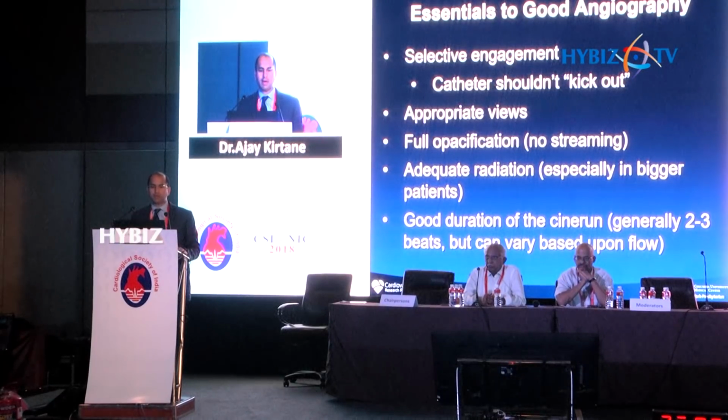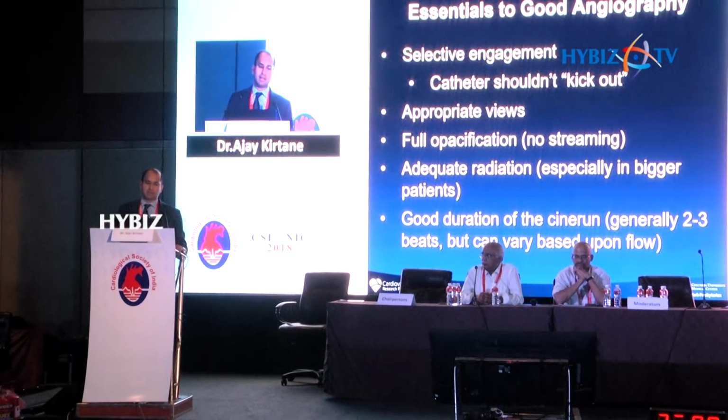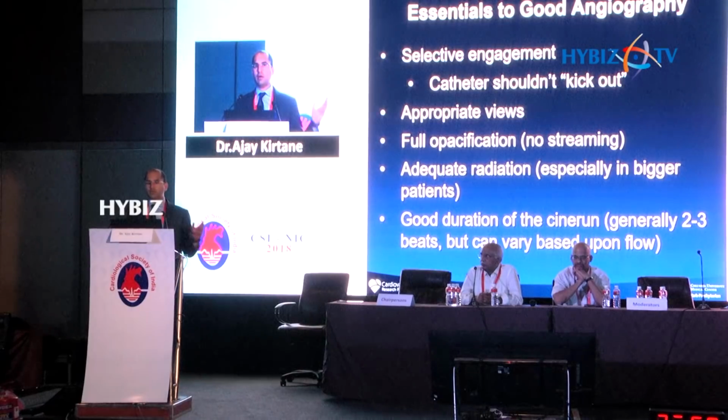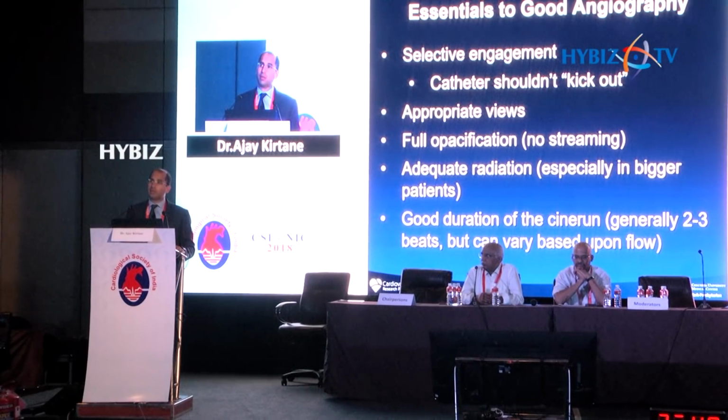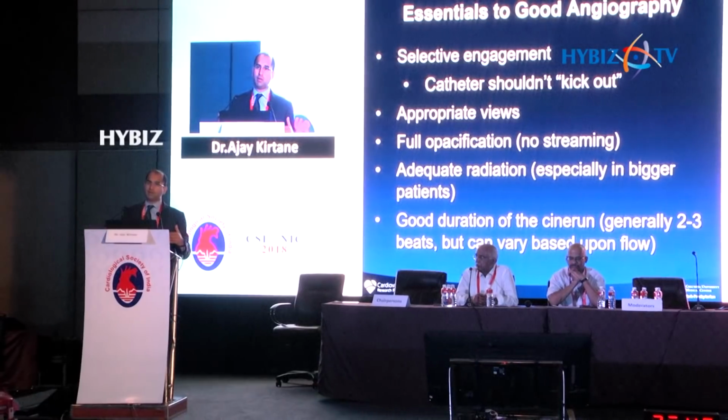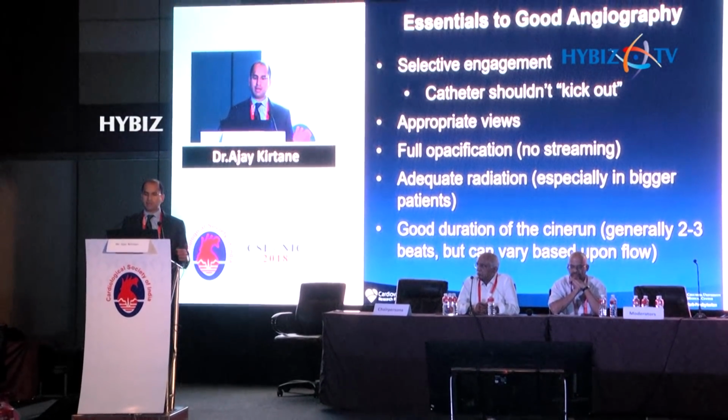So in terms of how you do it, remember, you have to be selective. The catheter should not kick out during the engagement, and I'll show some examples of these things. You need to have appropriate views with full opacification and without streaming. You want to have adequate radiation. We want to minimize radiation risk, but yet maximize our diagnostic potential.